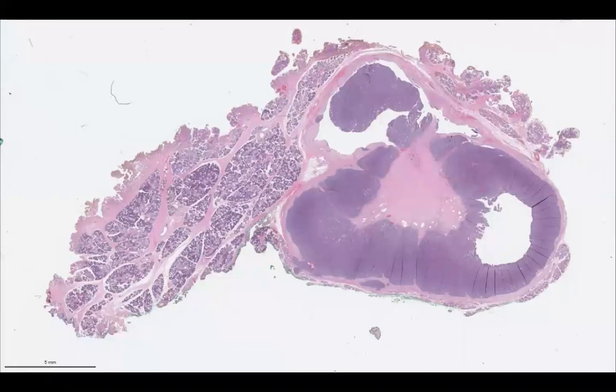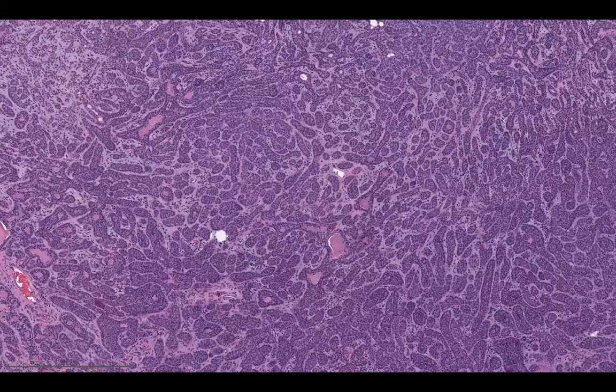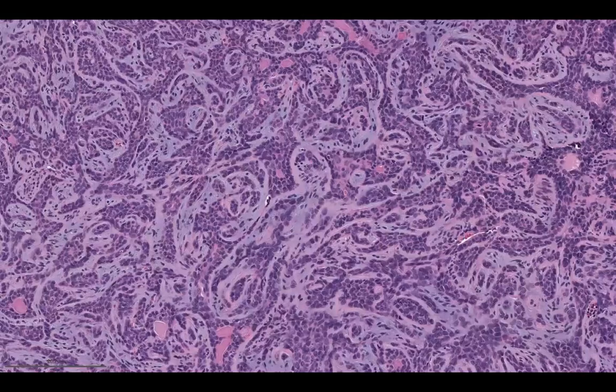Then we look at the histology and we can see it does look like it's infiltrating, and it's creating this neocapsule around it. Here we see some more infiltration down here. Then we go to higher power and we see something similar to the last tumor, the basal cell adenoma, a very basaloid population, meaning very high NC ratio. On higher power, it really does look like there might be a ductal component and then a basal cell component surrounding it. The stroma is a little less cellular, but there is some cellularity to the stroma here.